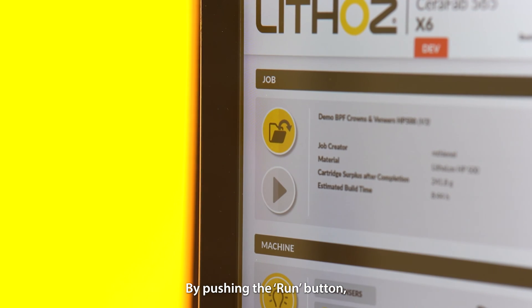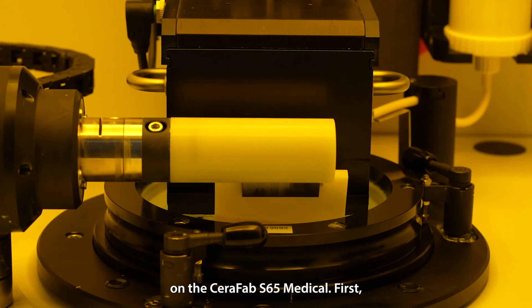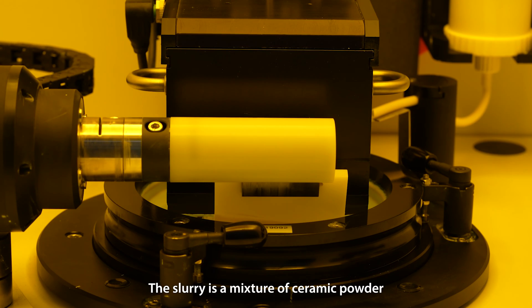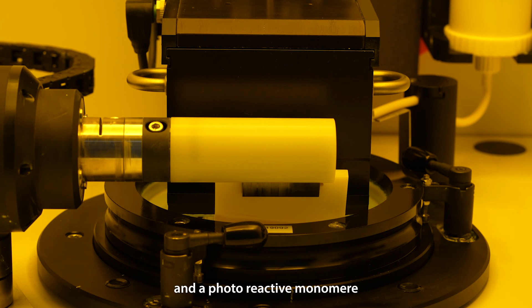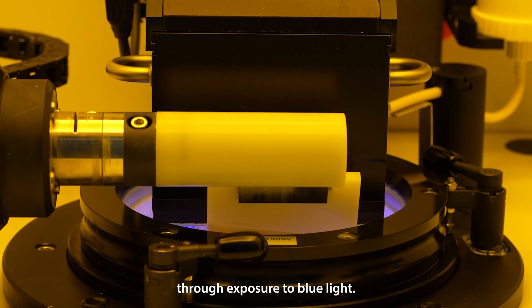By pushing the run button the print is started on the Seraphab S65 Medical. First, the build platform contacts the vat to perfectly adjust the height. The slurry is a mixture of ceramic powder and a photoreactive monomer that is polymerized through exposure to blue light.